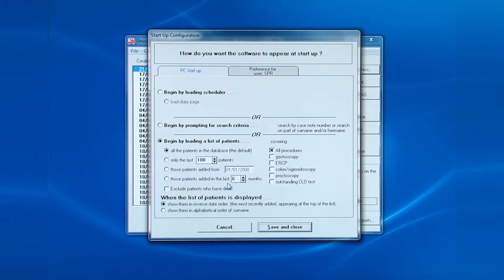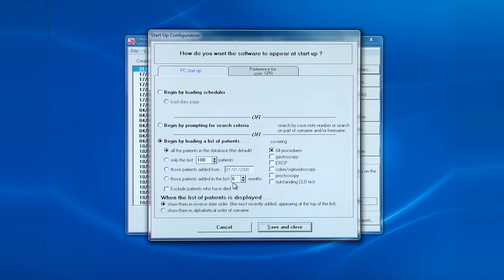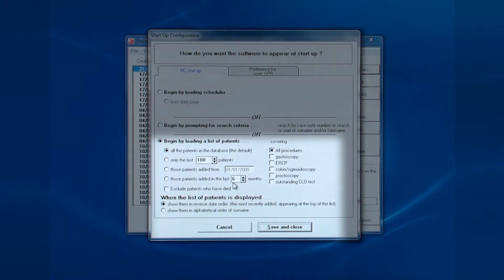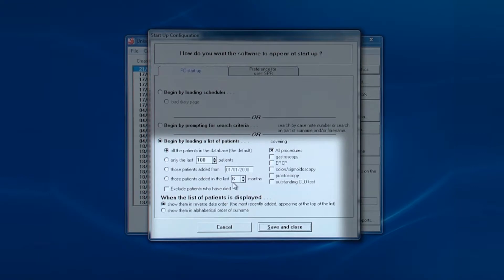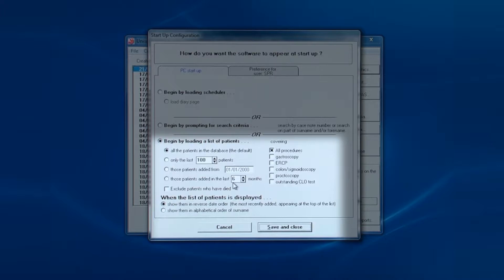Now there are three main options for determining how the software starts up. The default is by loading the list of patients for all procedures, with the most recent downloaded at the top of the list. You can change these defaults so that, for example, they only display the last so many patients, or those added since a certain date, or those added in the last so many months.